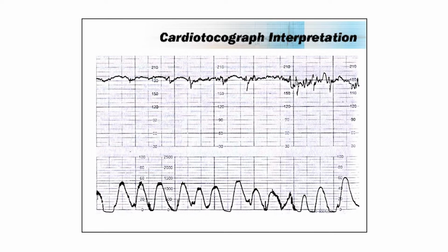Now this is your tachysystole. Yeah? Tachysystole, excessive frequency of contractions. And the TOCO is not set properly. It's not set to what we know to be normal intrauterine pressure, resting tone. It's not set properly. By the way, on this tracing also, this is oxytocin again. When the contractions are starting to become more reasonable, the baby's heart rate is starting to recover to normal.